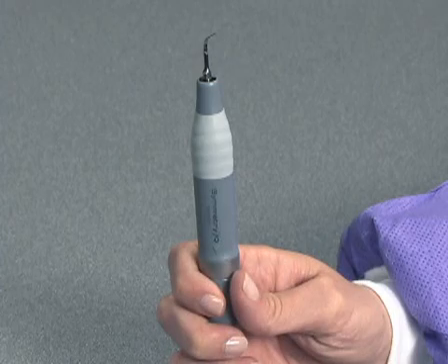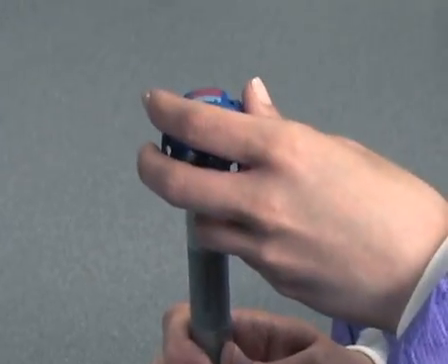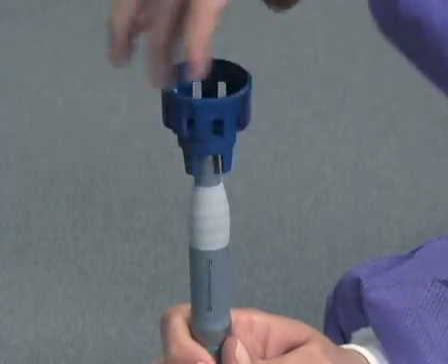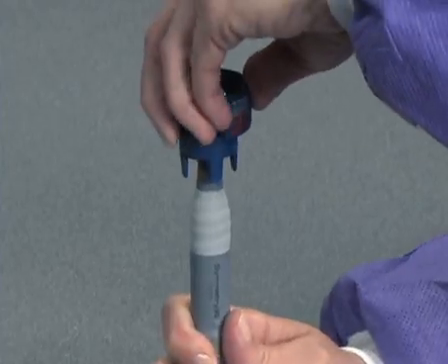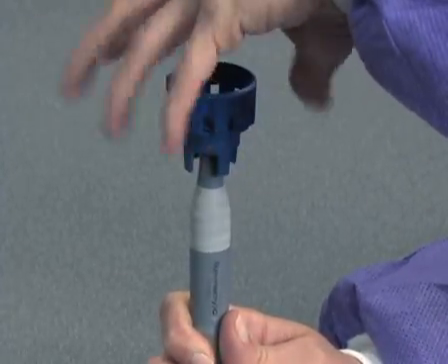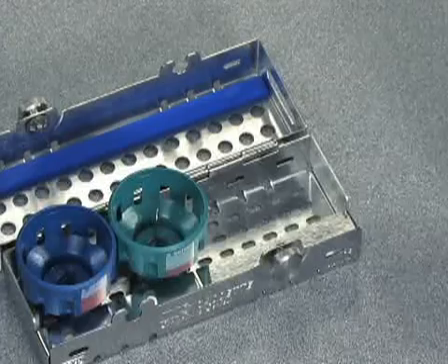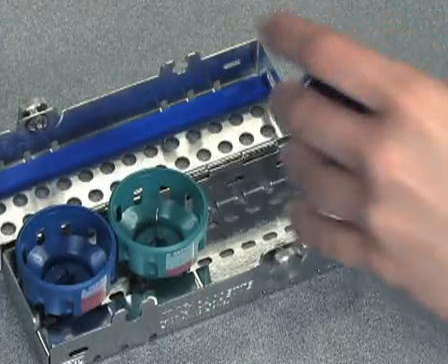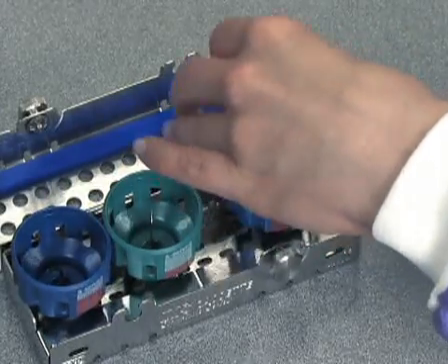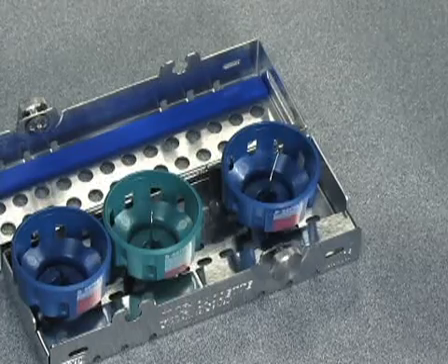Hold the handpiece vertically. Insert the tip through the hole in the bottom of the Guardian wrench. Rotate the wrench while depressing slightly to properly seat the wrench on the base of the tip. Once the wrench is securely seated on the tip, rotate the Guardian wrench counterclockwise to loosen and remove the tip from the handpiece. Once removed, there is no need to remove the tip from the Guardian — it can go through the cleaning and sterilization process in the Guardian tip carrier.